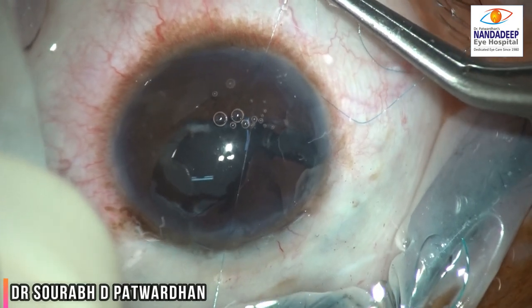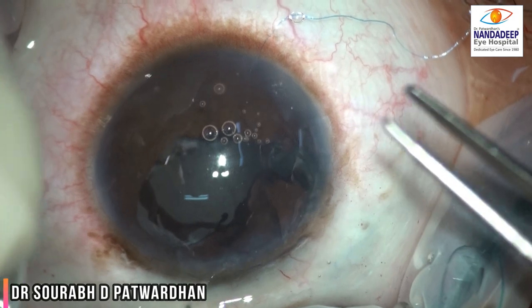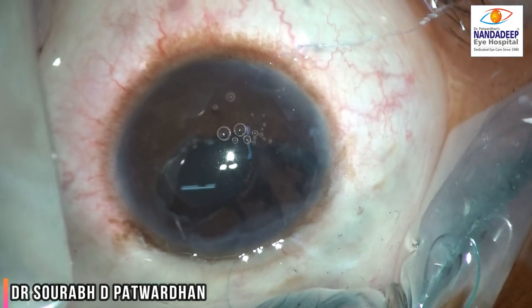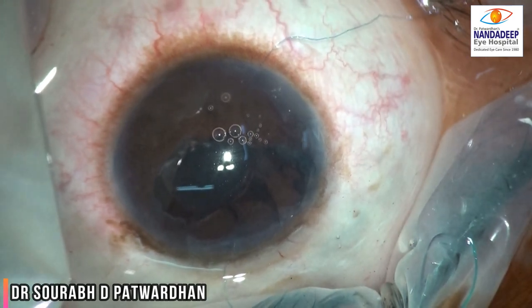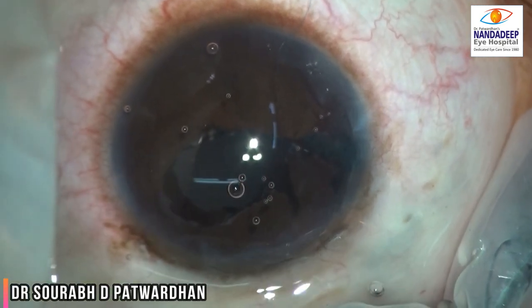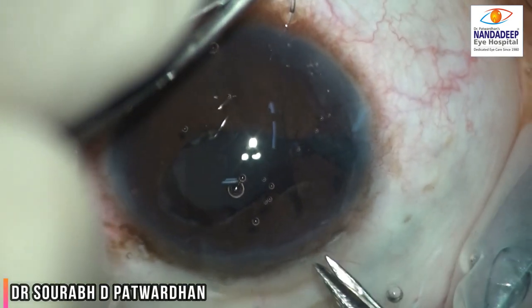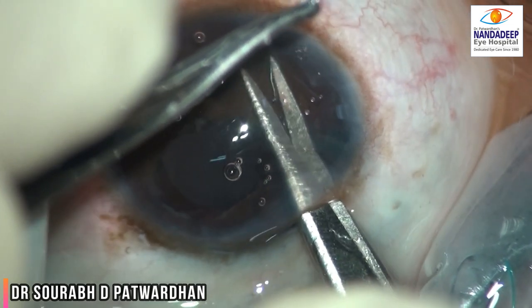After the iris defect was reduced, I had two options: one was to do SFIOL, but considering the microphthalmia, I decided I would rather do an iris claw lens in this particular case. So I took the required power of the iris claw IOL and was planning to do a retro fixation of the iris claw.